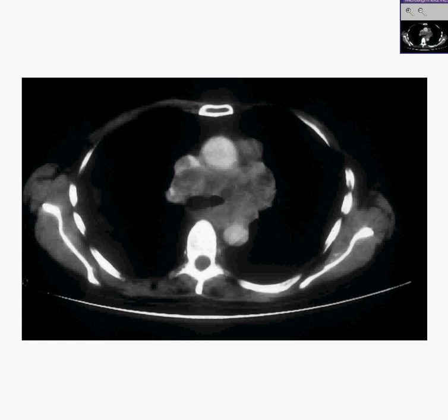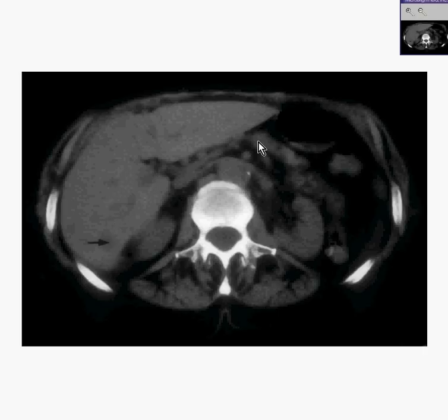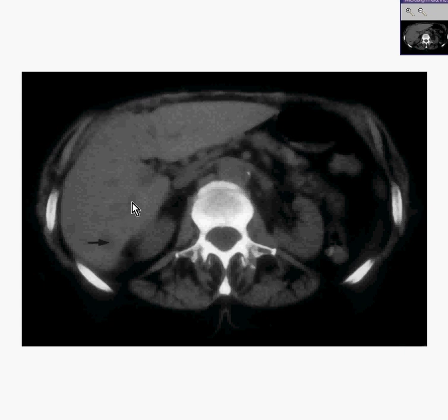Let's take another CT a little bit further down in the body, in the abdomen. Here's something that is going to be very subtle. There's the liver, maybe part of a kidney here, maybe an aorta here, probably some bowel here, posterior spinal muscles here. Look at these areas — for sure, and there may be even some more subtle areas. This is a liver that has a lot of subtle, not drastic, but areas of decreased CT density. This is a classical metastatic liver.